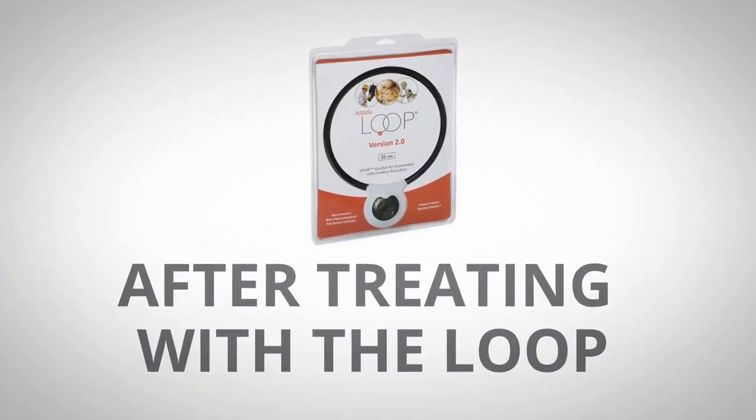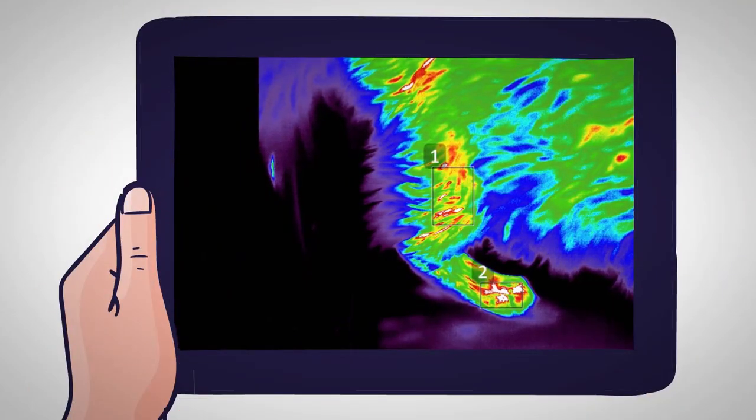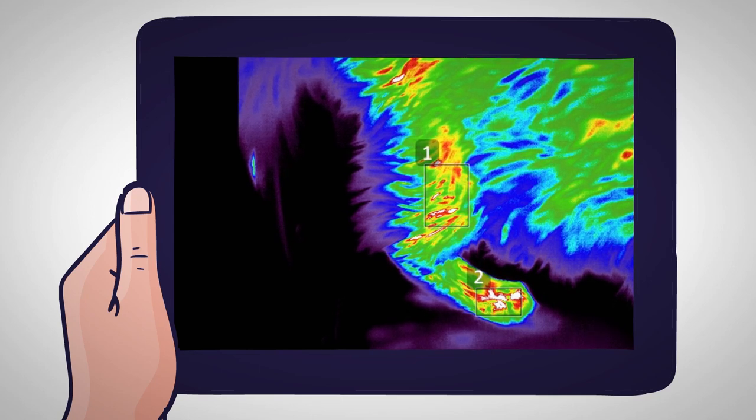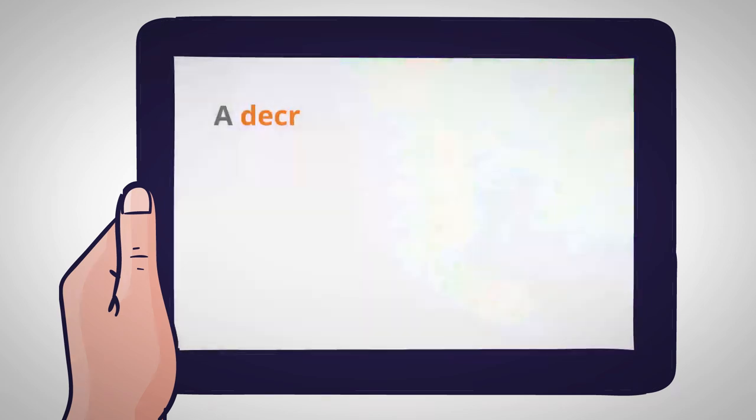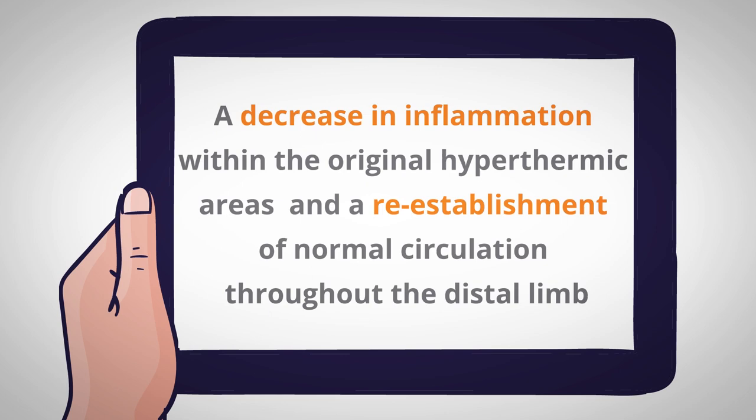After treating with the loop, the right stifle experienced a 91% decrease in the hyperthermic activity. Also, there was an increase within the thermal gradients throughout the distal limb. Interpretation: a decrease in inflammation within the original hyperthermic areas, and a reestablishment of normal circulation throughout the distal limb.